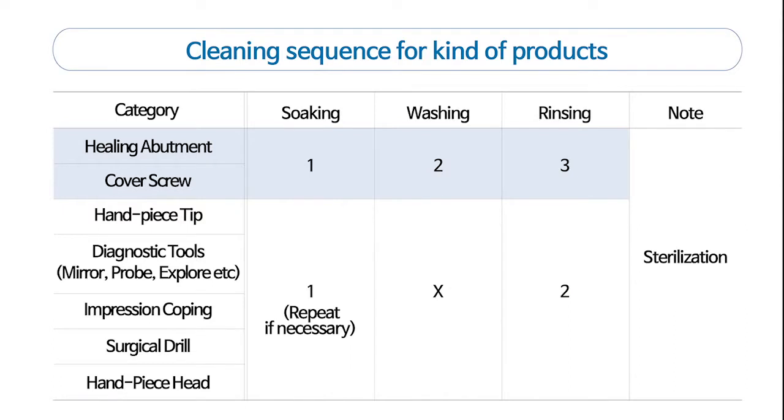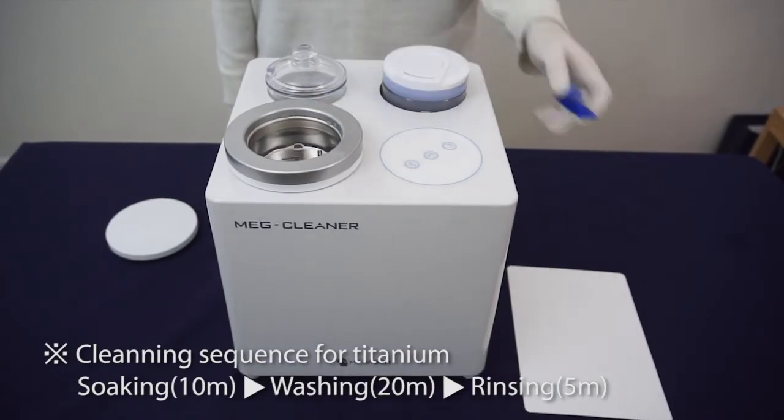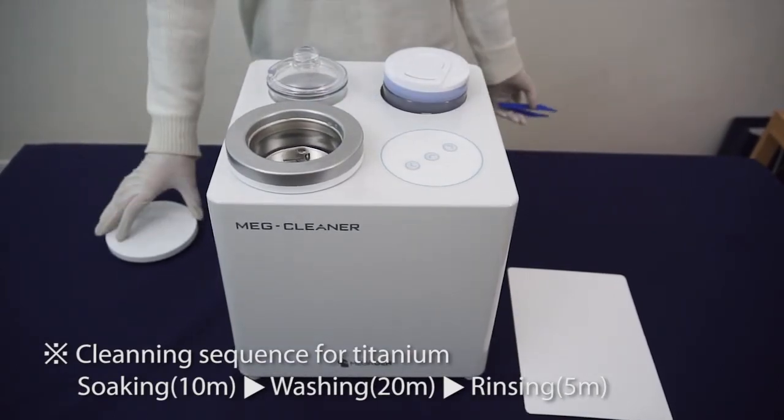The cleaning sequence depends on the materials. The titanium materials cleaning process is soaking, washing, rinsing.